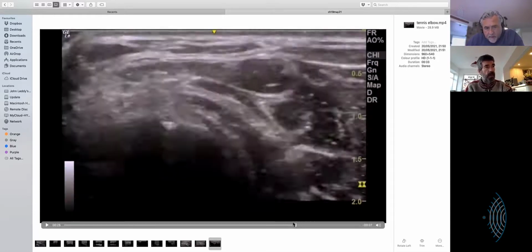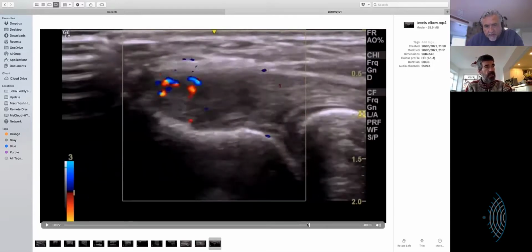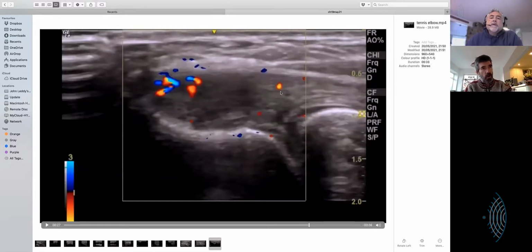Right. That's there. So this doesn't quite look as good as you would normally do, because you are just following those fibers rather than the main body of it. But you still get the bone, and you see the abnormal portion. And you get that linearity of the fibers, because they are coming in like this.